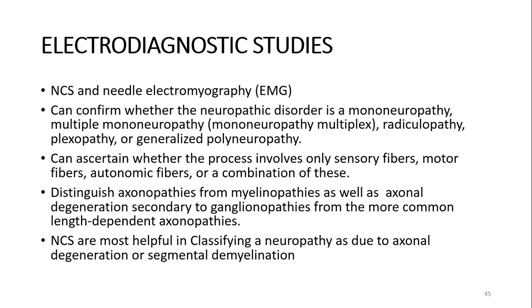Specifically, nerve conduction studies usually study the large myelinated fibers, which give afferent innervation to the muscles as well as efferent innervation to the muscle, and the ones that carry afferent sensations for proprioception, position and vibration sensation. So those nerves are the ones studied by nerve conduction studies.